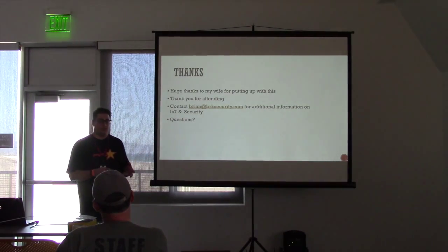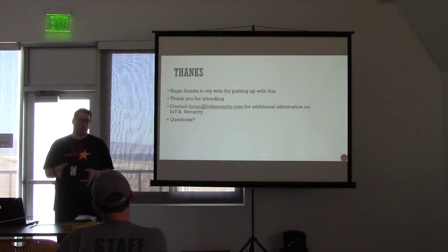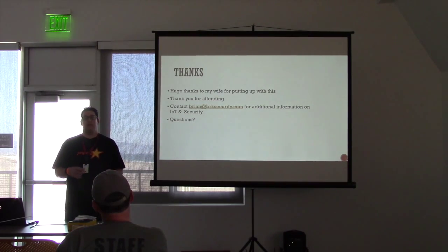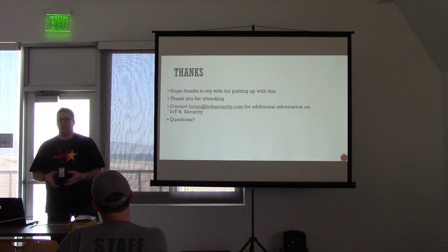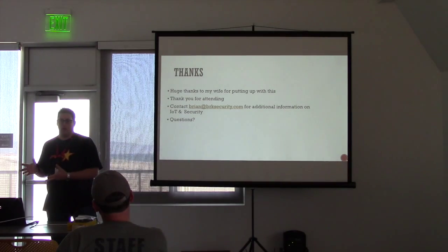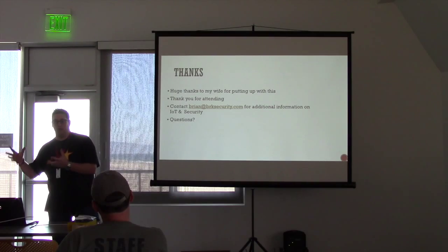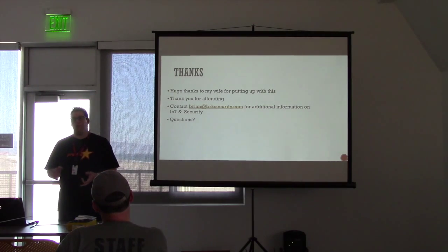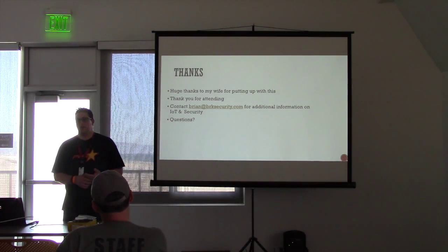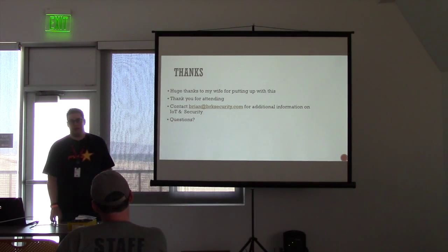When you have a defibrillator whose intended consequence is not to defibrillate through the wireless signal, like it was done by Barnaby Jack and those people, the FDA doesn't consider that in approving those devices, because it was never in the consideration of what it was supposed to do. The wireless was for programming, not for actually executing that shock. And so they won't even consider those consequences that aren't in what they call the unintentional intended path. It gets kind of ugly.